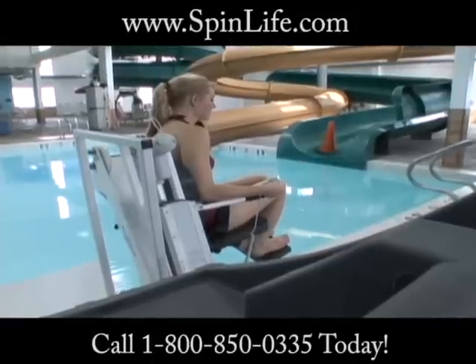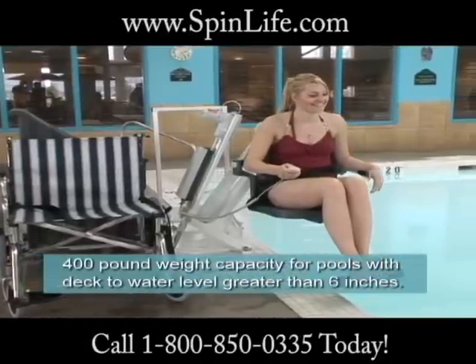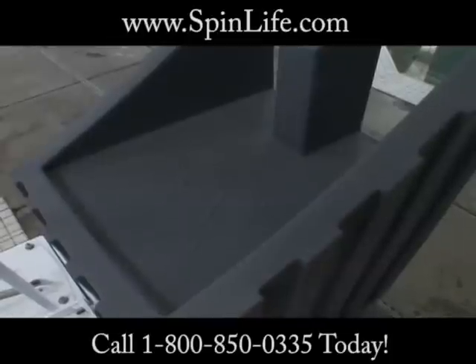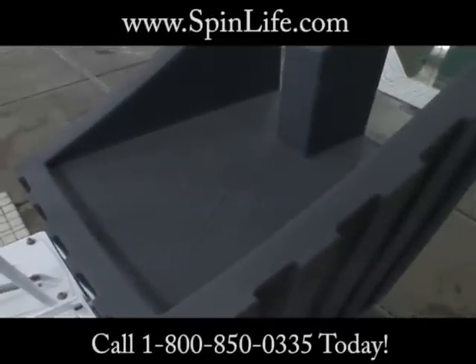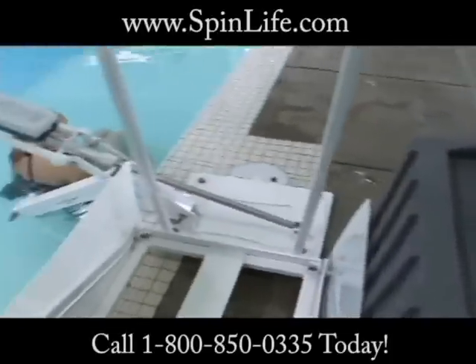Reinforced concrete counterweights provide a lifting capacity of 450 pounds, while totally eliminating the possibility of corrosion. The counterweights are covered with a roto molded, medium density polyethylene cover, further protecting the counterweights from the environment.